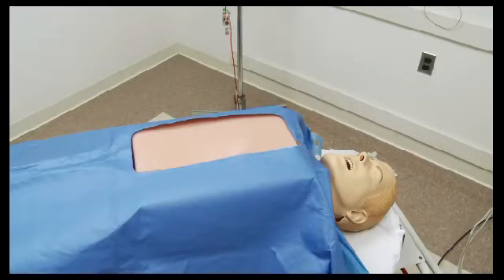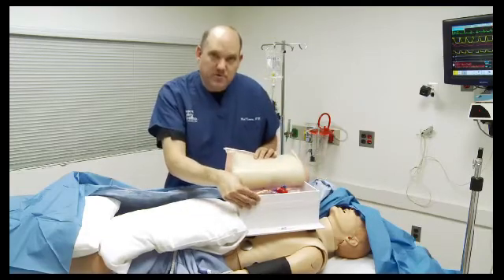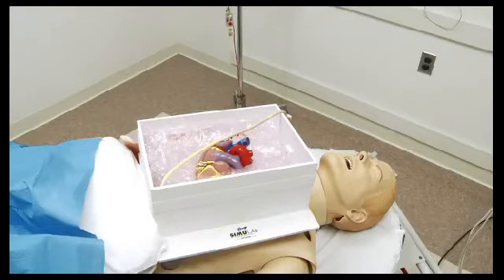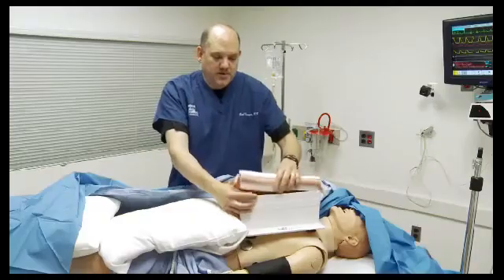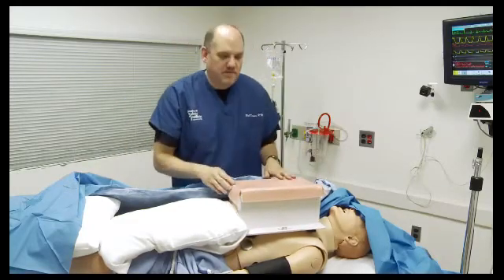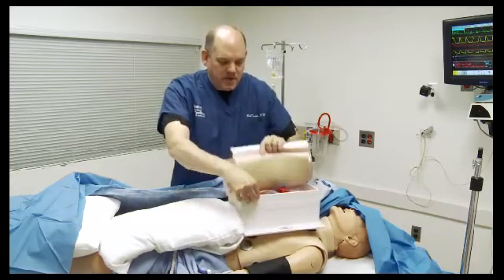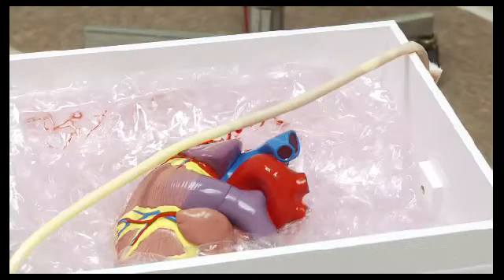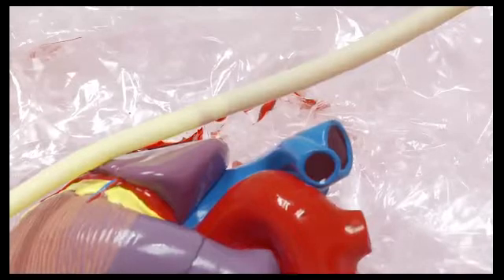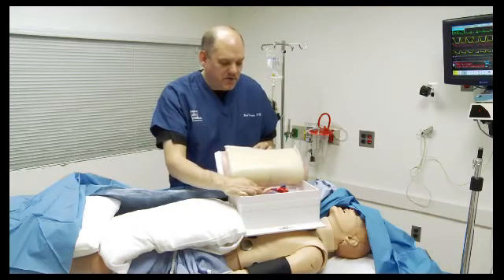So the surgeons will cut through the outer layer of the chest, cut through the fat layer. Inside the box, we have assembled a little surgical project for them to work on. We have a ceramic heart. Our particular simulation center does not have a permit for human tissue, so we had to put something semi-realistic in there. The bleeding blood vessel itself is a piece of latex tubing that we've made a little incision in, and we will instruct the surgeons to ligate that piece of latex with some suture material.